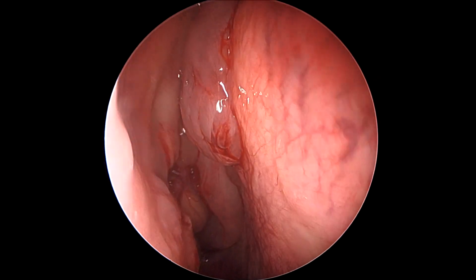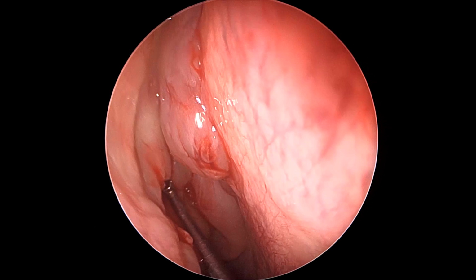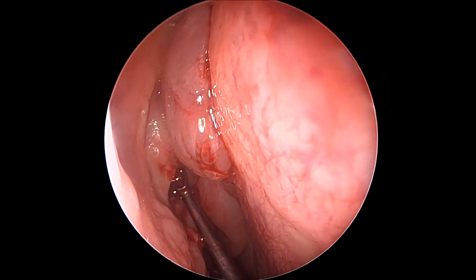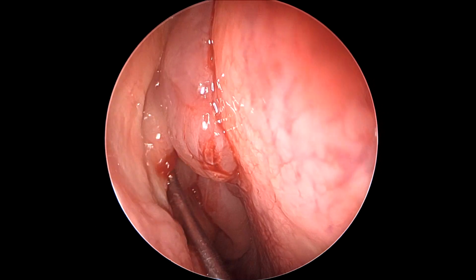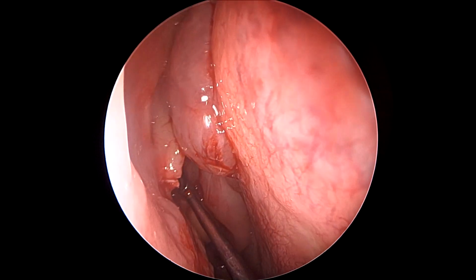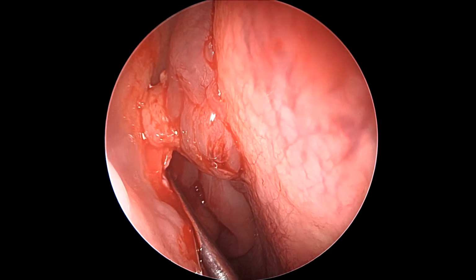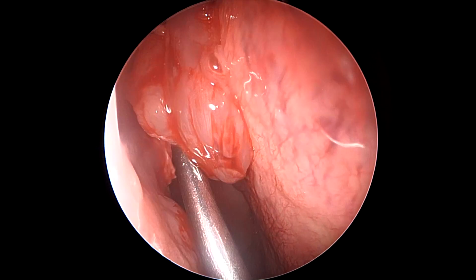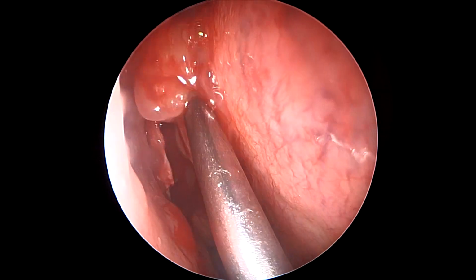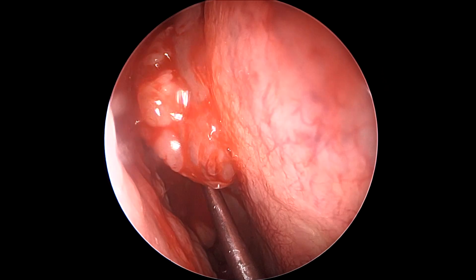As we create one or two incisions down to the hard wall of the maxillary terminal maxillary wall, we do not have to go much more anterior because that can disturb the nasolacrimal duct. And once we have given a broad, sharp cut flush with the lateral nasal wall, we can use either a ball probe or, in this situation, a frontal sinus seeker, which helps us invert and outfracture the uncinate process, also popularized by Professor Peter Wormald as the swing door uncinectomy.